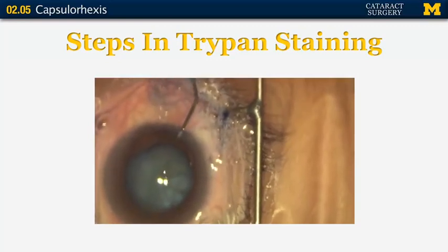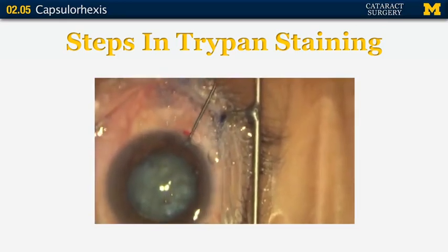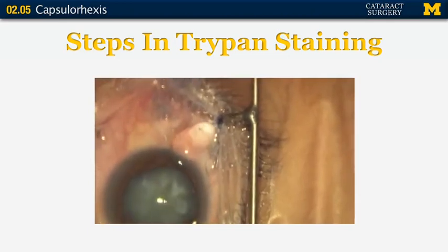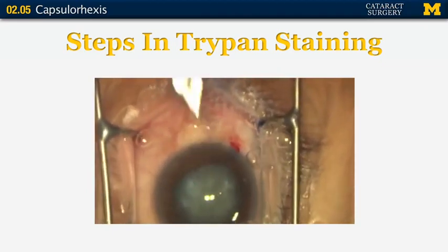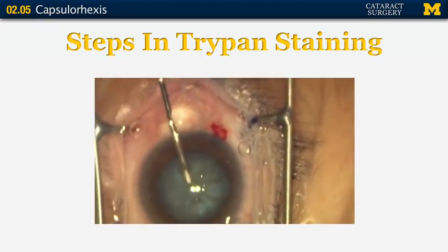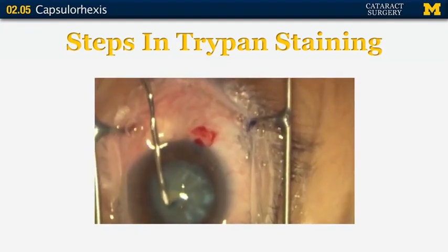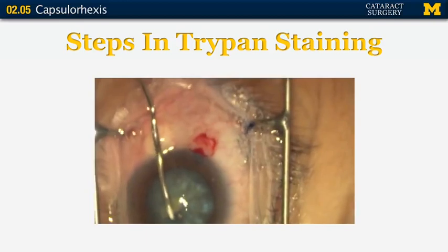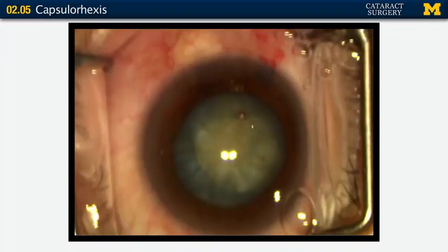Next we put in a visco-dispersive agent and then a visco-cohesive agent for a soft shell technique, with the dispersive protecting the endothelium. Then we start making the capsular opening with a cystotome so you can see the difference between the stained capsule and the totally white cataract — and how the staining makes your capsular opening visible and helps you see where your flap is. Without the stain, the flap would be completely colorless and clear — impossible to see.